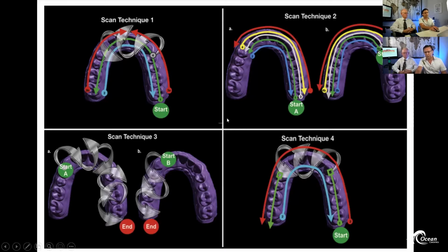And let's do another little trivia between 1, 2, 3, and 4. Which one does anybody think out there is the most accurate scan pattern? Because some manufacturers of any scanner, they'll pitch, this is the best scan pattern. And we put a lot of faith in our suppliers, but I want to show the data of what's the most accurate scan pattern. Because at the end of the day, what we're doing with the scanner is stitching data together. We got a number 2. Okay, that's a vote for number 2. Anybody other votes out there? 3 more votes, so we're not moving on. Okay. Just kidding. Well, we got another 2.